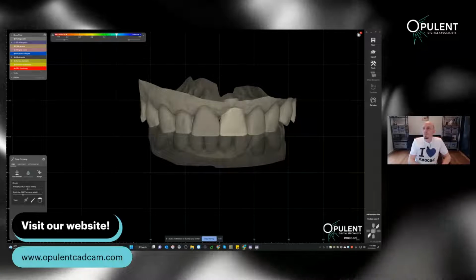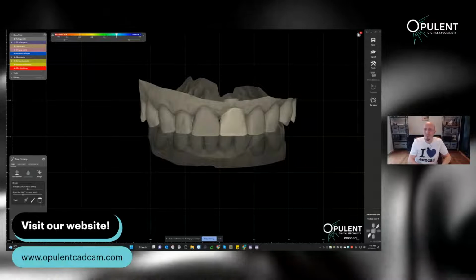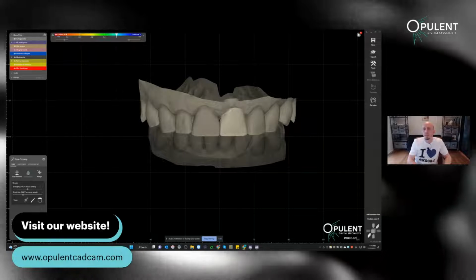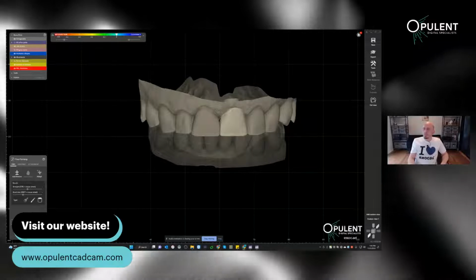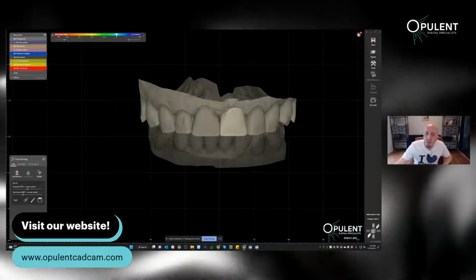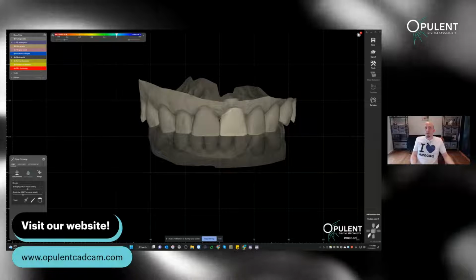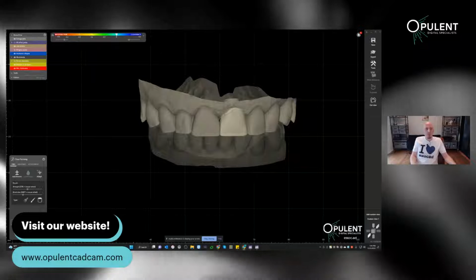I will tell you a little bit about Exocad. You probably already know it in and out, but maybe there are a couple of people who don't. There are always new followers, new people buying equipment, and not everybody knows it. And today, as you saw in the intro, we're going to look at the implant module. So what's new in the Rijeka version?